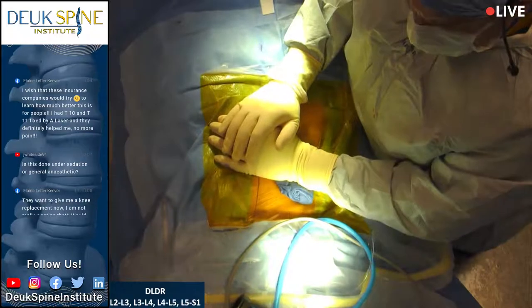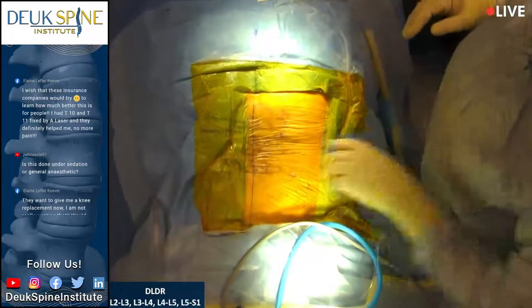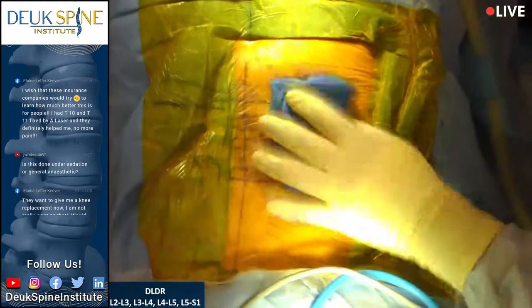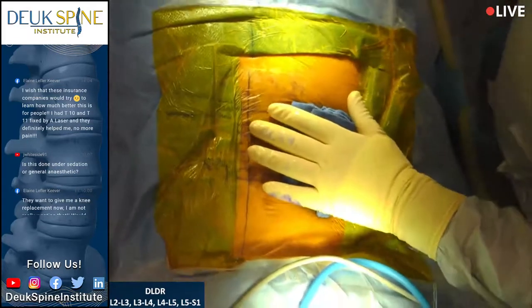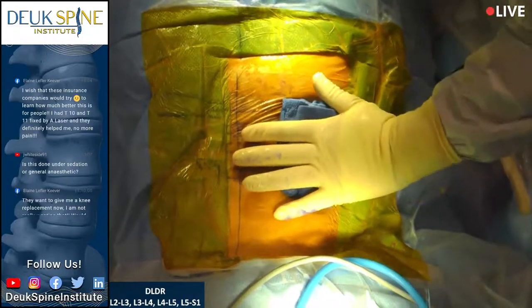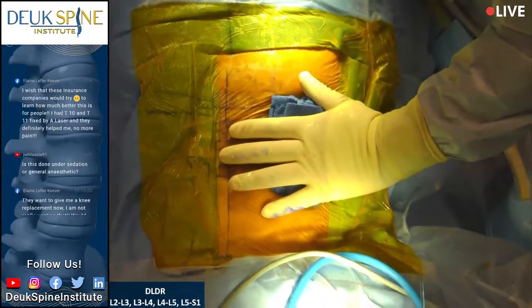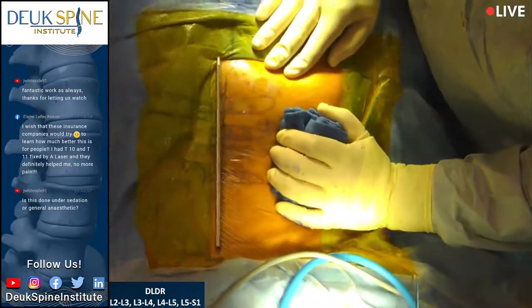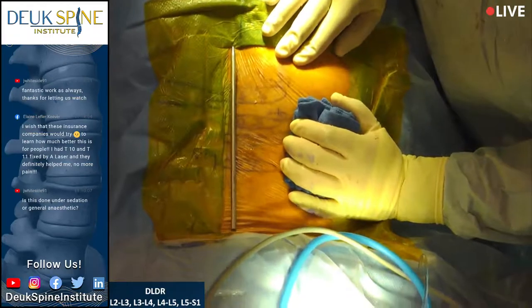Hey, lay still, we're almost done. All right, we're gonna put 2 stitches, but you can see the incisions, guys. Very small. You did great. I just want you to know, if we had done a fusion surgery, the incision would have been this long. Can you guys see this, Flynn? Lay still. Yes, we can, doctor.